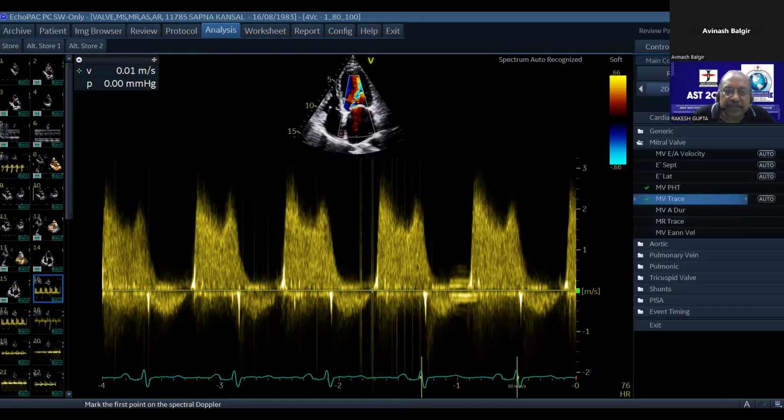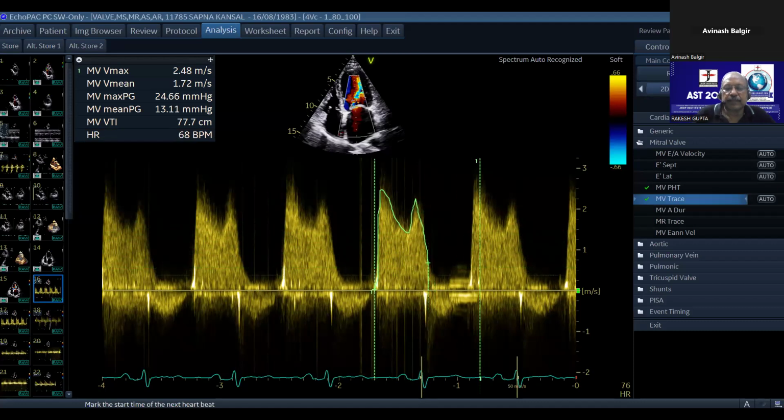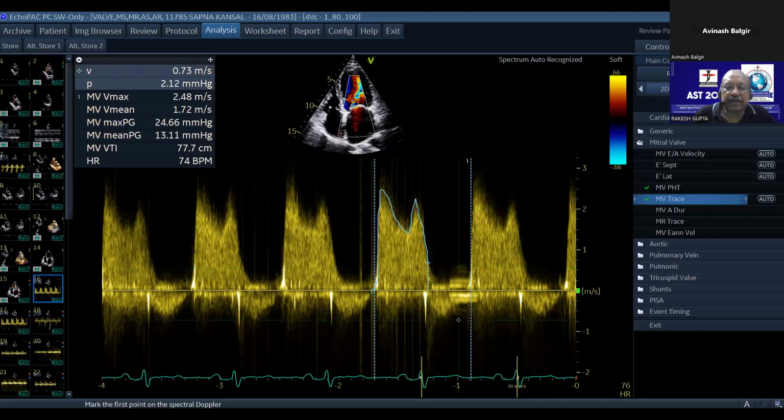I'll start with the baseline, go up along the line, come down, and that gives you heart rate.